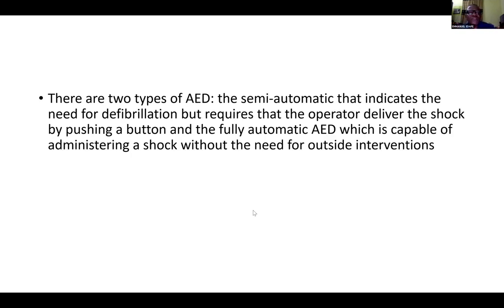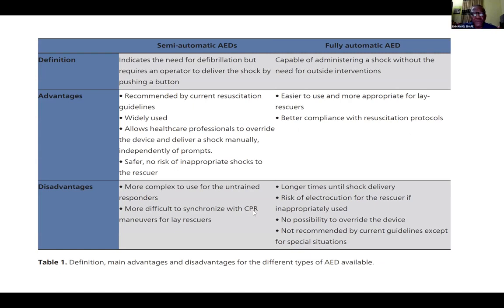For those that are semi-automated, as we said, you require the assistance of a bystander to press the button, but it gives you the analysis and talks to you: is it a shockable reading, apply shock, then you apply the shock. The issue is that it gives a little delay, because you require human effort to press the button. It is also used by paramedics because they are trained to go into the community and get this patient. While transporting them to the hospital, they can use it and apply shock when necessary.